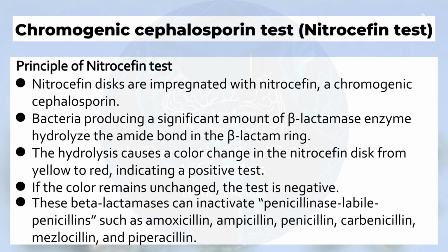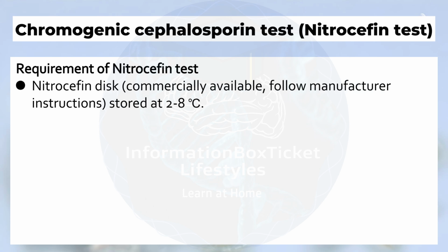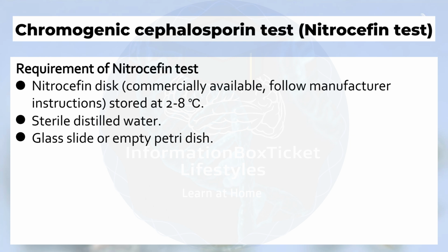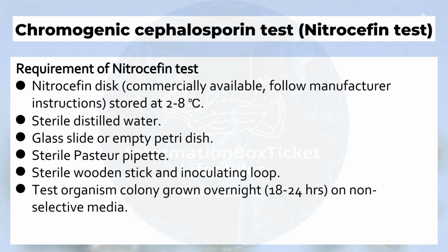These beta-lactamases can inactivate penicillinase-labile penicillins, such as amoxicillin, ampicillin, penicillin, carbenicillin, mezlocillin, and piperacillin. Requirement of nitrocefin test. Nitrocefin disc, commercially available, follow manufacturer instructions, stored at 2 to 8 degrees Celsius. Sterile distilled water, glass slide or empty petri dish. Sterile Pasteur pipette. Sterile wooden stick and inoculating loop. Test organism colony grown overnight, 18 to 24 hours, on non-selective media.